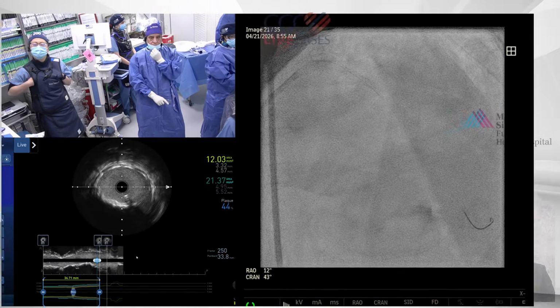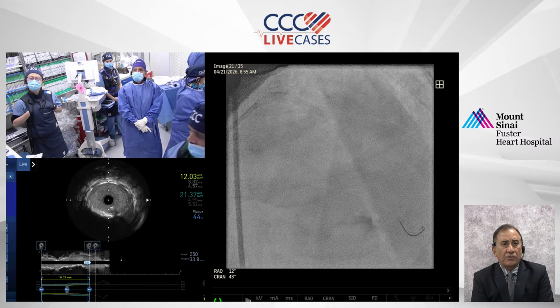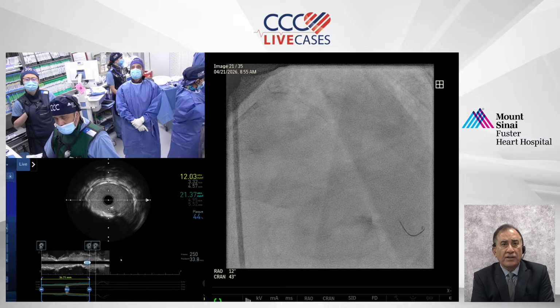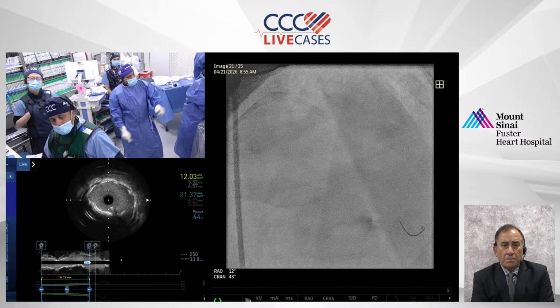I thought one of the reasons also to stent it is it may have been induced by the guiding catheter, and you don't want to take a chance of the vessel shutting down. No, I don't think it's guiding. But we've been very careful. Now let's study the angiogram a little more. Okay, go back. What's happening there?